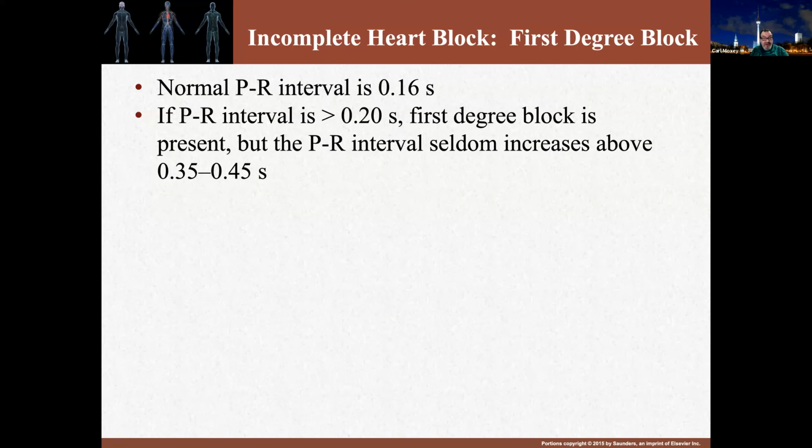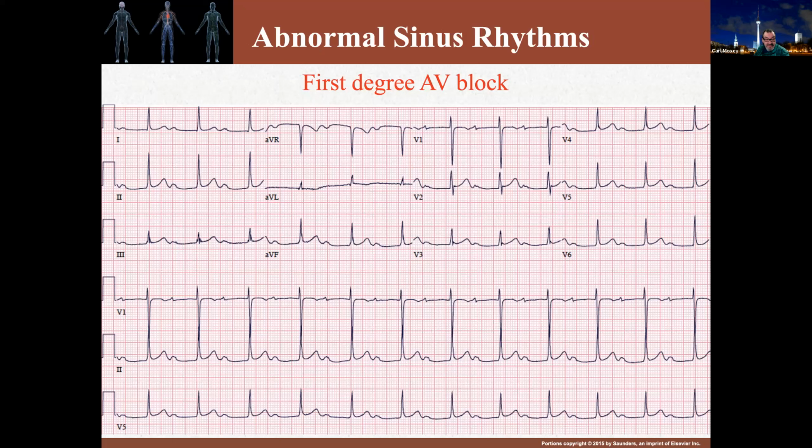This AV block is generally asymptomatic and can only be detected through an EKG. Usually this condition is not that serious and is quite frequently treated as benign even when discovered. However, if it's accompanied by an acute MI, it can lead to some very serious atrioventricular defects. It can further aggravate the problem. So how do you detect a first degree AV block on the EKG?